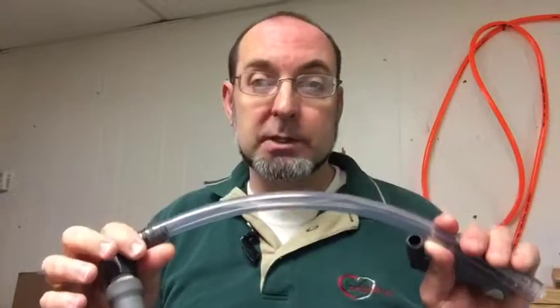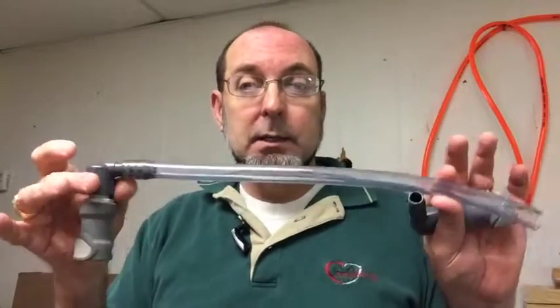We use an antimicrobial tubing. It's a clear tubing, but it's thicker, it's an eighth of an inch thick, it's plenty heavy duty, and it's impregnated with a silver compound that will keep that tubing from forming any biofilm inside it. So it'll help keep the water quality better inside the tubing. It should last a little longer.